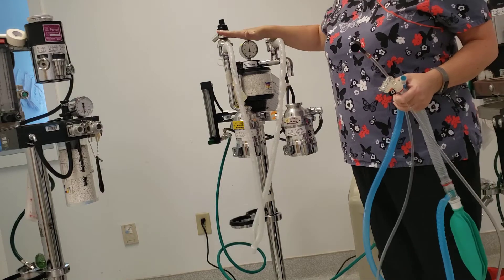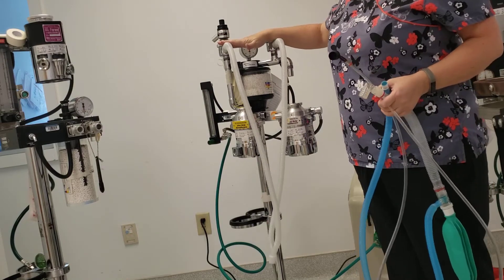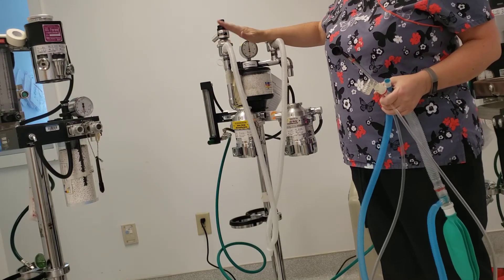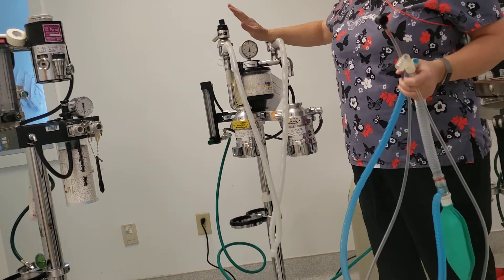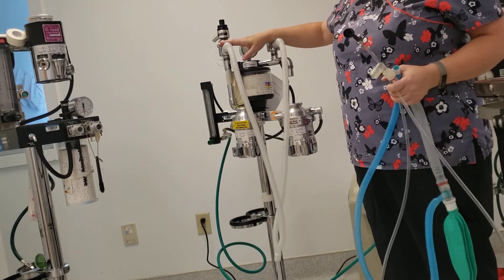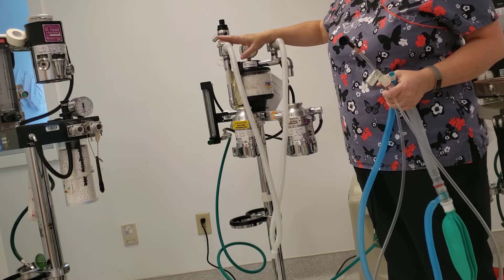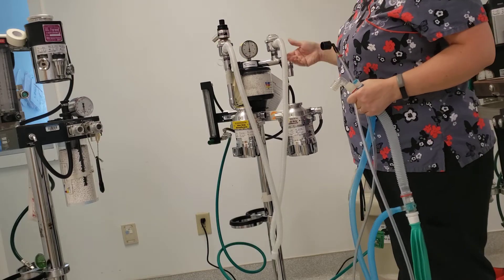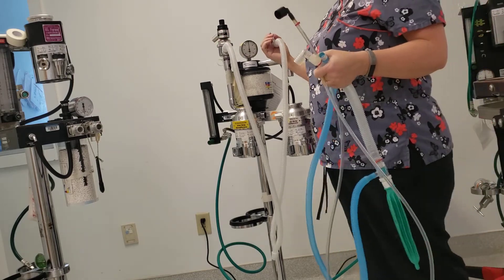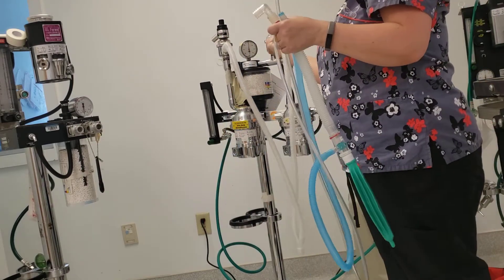Not every patient is going to be able to use the re-breathing system. Those are reserved for patients definitely over 20 pounds. Your 15 to 20 pounds — 10 to 20 pounds — is your gray area. It depends on your patient; they may also use the re-breathing system. Patients under 10 pounds will use what's called a non-re-breathing system.